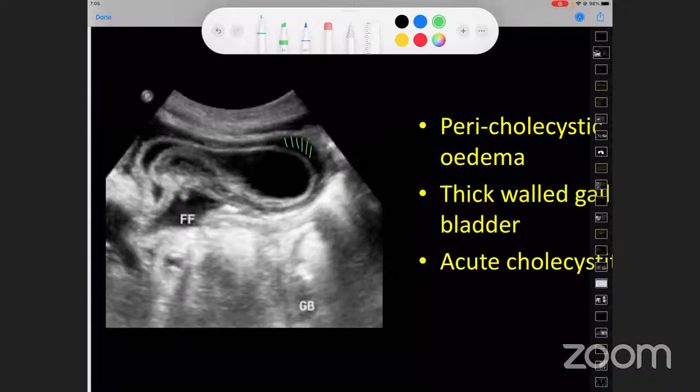Okay, so Avik, is this the pericholecystic fluid collection around? I do think this is small, or it is an edematous gallbladder. It is gallbladder edema, and the fluid is usually hypoechoic on ultrasonography. So probably this is the pericholecystic collection. You could see some collection around the neck region of the gallbladder as well. So it is a gallbladder with wall thickening and pericholecystic fluid collection.